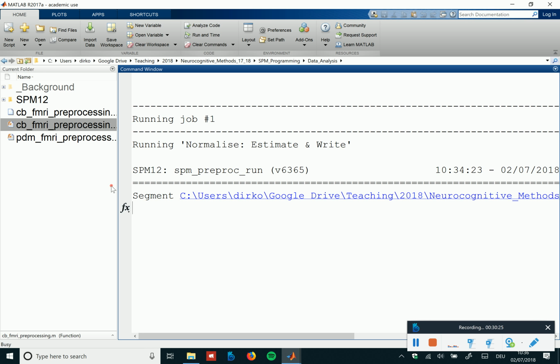But then I decided not to emphasize pre-processing so much, but rather statistical modeling, because after all, the cognitive stuff and the things about how the brain works come in at that level, and not at whether you filter the data a little bit like this or a little bit like that. Although it, of course, influences your final results without question. So that was everything I prepared for the waiting period. So we have to now be silent until the thing is done.